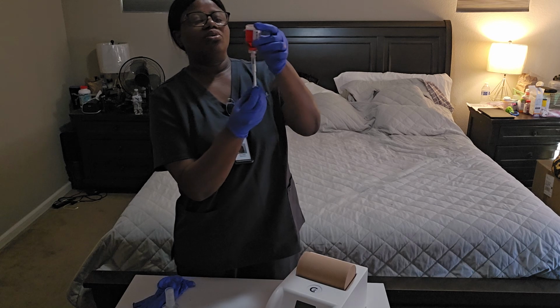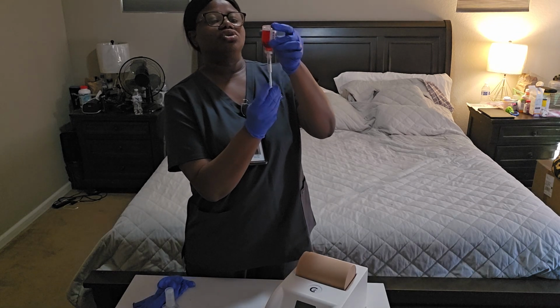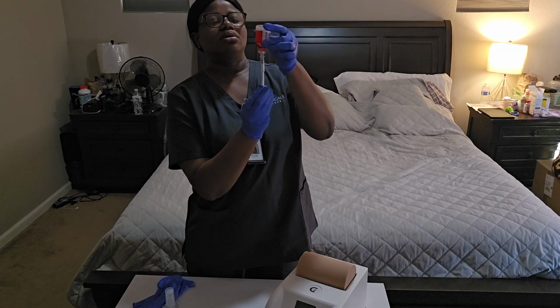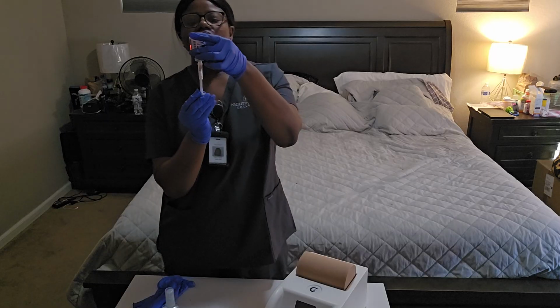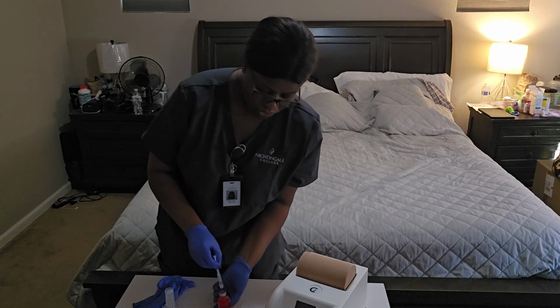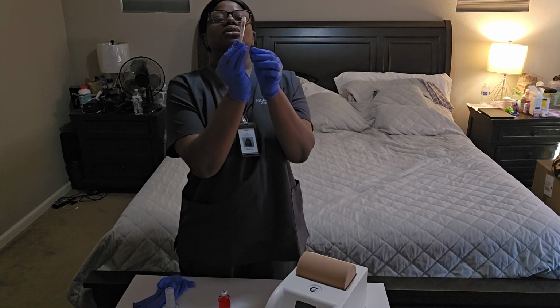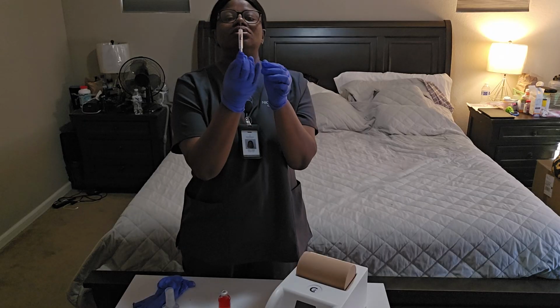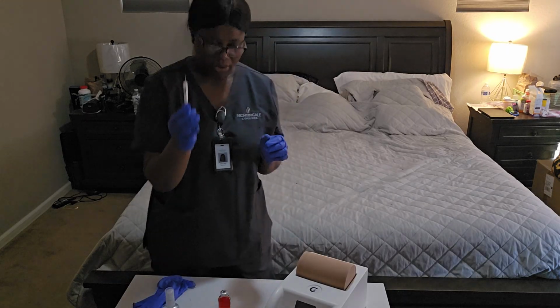If there is a bubble, I'm going to tap to get rid of the bubbles. I'm going to gently draw up 0.1 ml and take it out. Okay, everything looks good, no bubble, 0.1 ml.